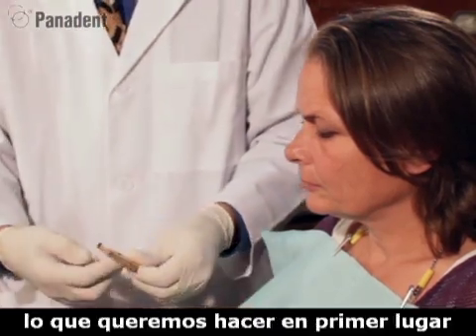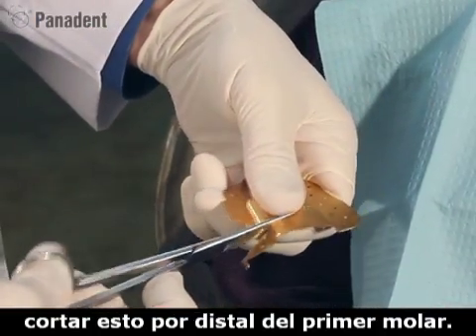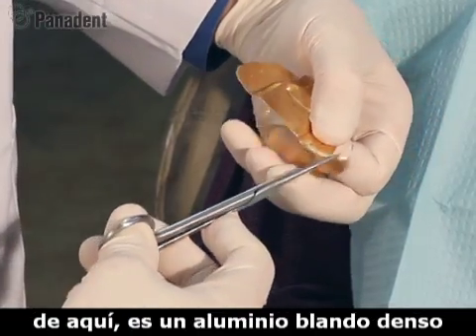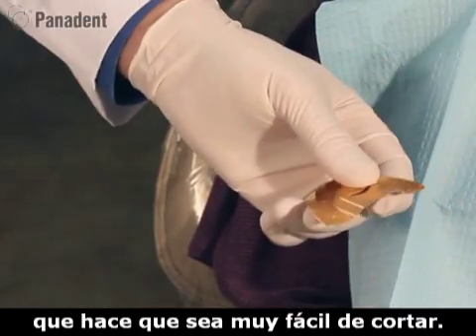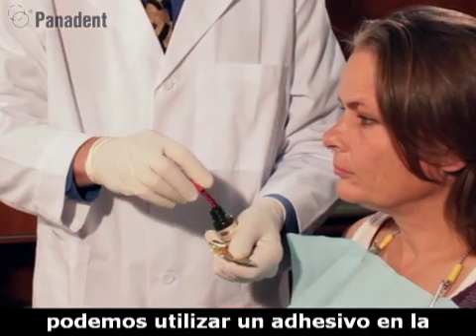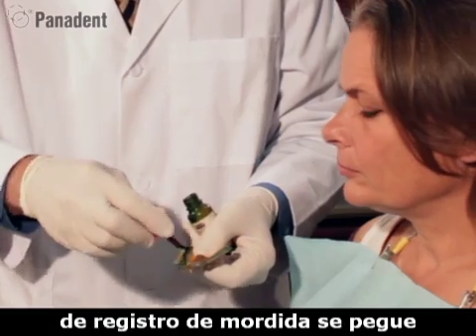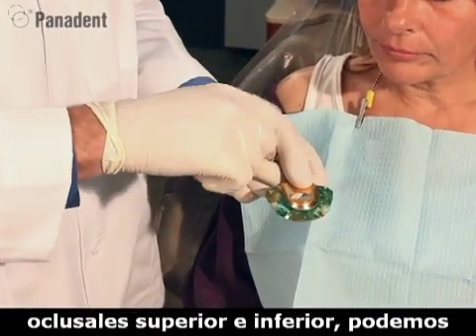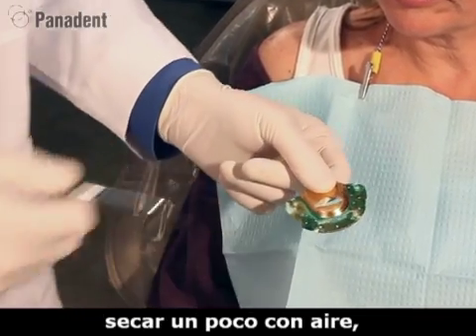So in doing that, what we wanna do first is size the tray. We can cut this back just distal to the first molar. So I'm gonna cut this back a little ways here. And so it's a dead soft aluminum, which makes it easy to just cut real easy. So we have that. Now we can actually use an adhesive on the tray, and this will help the bite registration material stick well to the tray. So we have a nice coat of adhesive on both the upper and lower occlusal surfaces. We can actually air dry that a little bit.